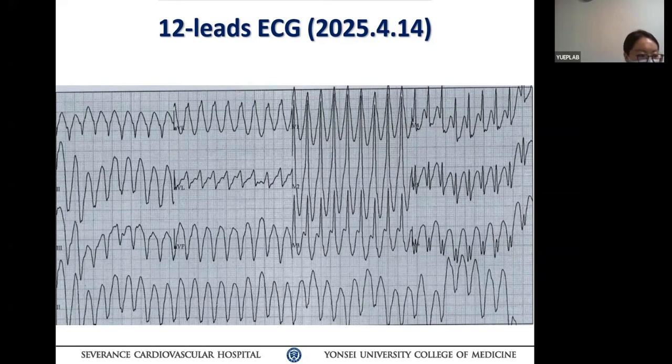The extreme axis is one. Right. aVR. Good. The initial R wave in aVR is another. Yes. What else? The prolonged intrinsic deflection suggests myocardial conduction rather than conduction system, which suggests a ventricular tachycardia.